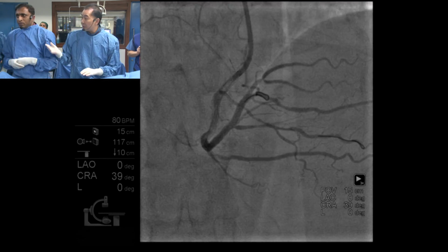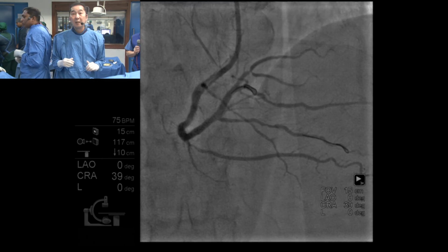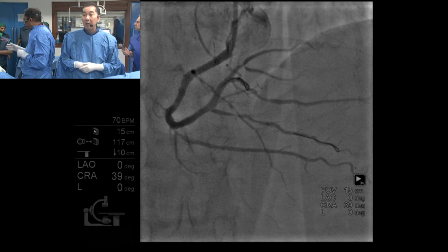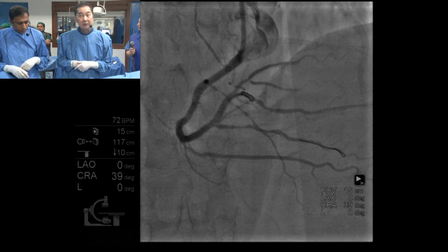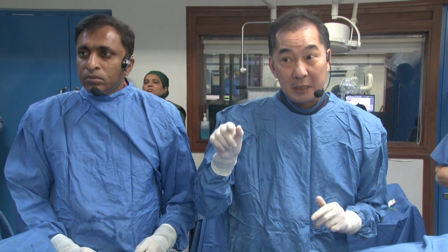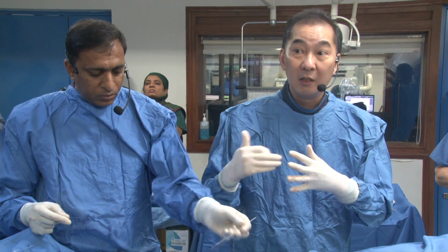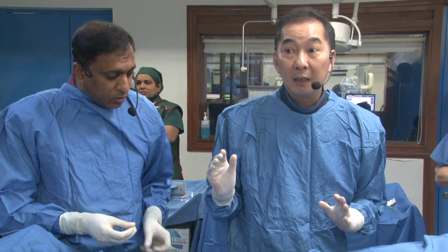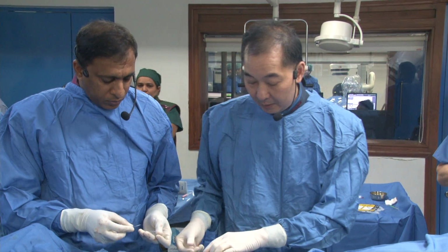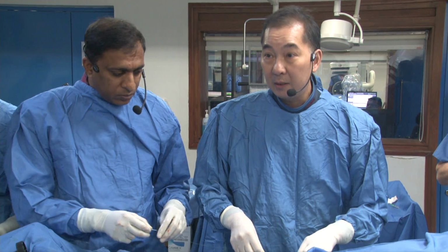Right? So Tuck, let's get a POT 3.5 balloon. You routinely dilate the side branch? No, I don't routinely dilate it. I typically don't, unless the side branch is really tight, with a lot of plaque there, which I saw by OCT in the beginning. When I see this lesion, I think I want to put a small balloon in with the stent together. This is not a typical technique. But since you did dilate that a little bit, should you rewire the side branch now?